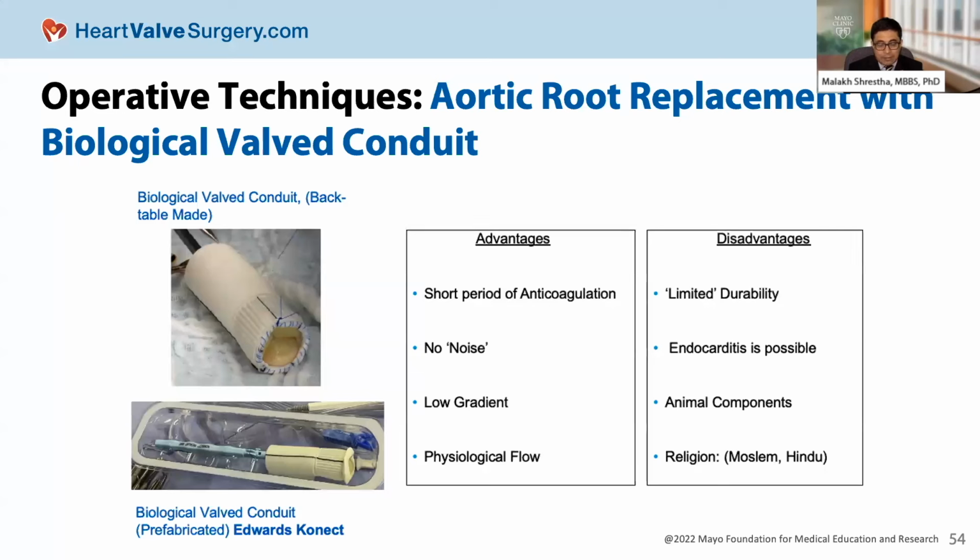The disadvantage again is limited durability. Limited means that it could be 15 to 20 years, but again, it doesn't last forever. So if someone is, let's say, above 65 or 70 years of age, the chances are that if we implant this valve, they will not have to come back again, because the valve would last longer. Of course, endocarditis is still possible theoretically, and it is made from animals, so it has animal components.